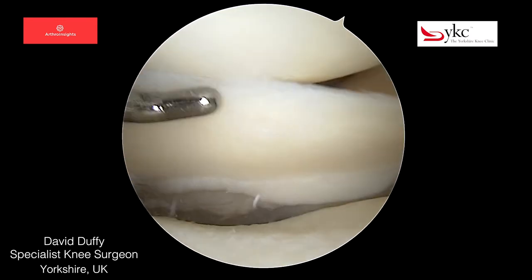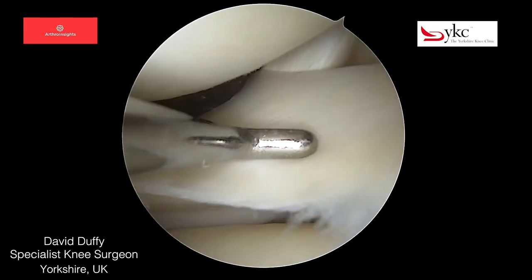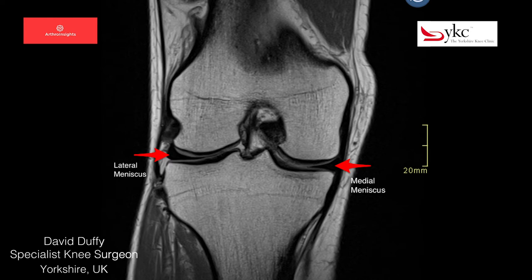The popliteus tendon passes through the joint, and the tendon is the structure running diagonally at the back of the meniscus. Both the medial and lateral menisci have been highlighted on this coronal MRI.